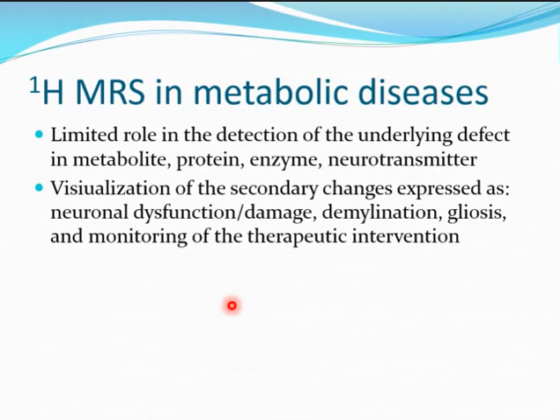So, in some metabolic diseases, it has a limited role in the detection of the underlying defects, for example, proteins, enzymes, neurotransmitters. The visualization of the secondary changes can be expressed as neuronal dysfunction, damage, demyelination, gliosis, and monitoring of therapeutic intervention.